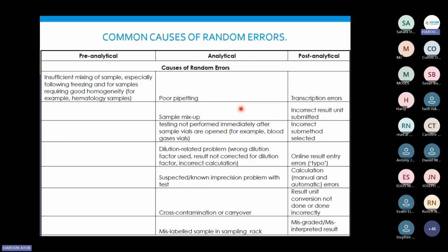Remember, when you're pipetting and you're creating so many bubbles in your tube, the pipette will definitely pick the bubbles. Remember, the chemistry analyzers have sensors. The sensor is what usually determines which level I'm entering. So if I have this particular tube and my level of EQA sample is here, the pipette will go, and the moment it detects a signal that it has reached some liquid, it stops. So if it stops at the bubble, remember, it will aspirate the air. That is for ALT. When it goes to AST, the bubble has disappeared because it has been punctured.